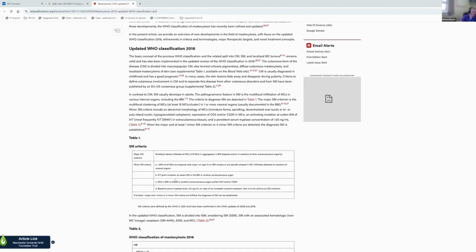And I think it's a reasonable core. So you could argue that you didn't see one of these infiltrates because the marrow was small, so you didn't sample it. But I think it was a decent, adequate core. So I think this patient has got away without a diagnosis of systemic mastocytosis. And it could well be that they're increased in the marrow just as part of a response to a cutaneous mastocytosis.